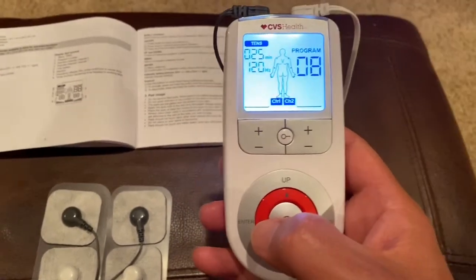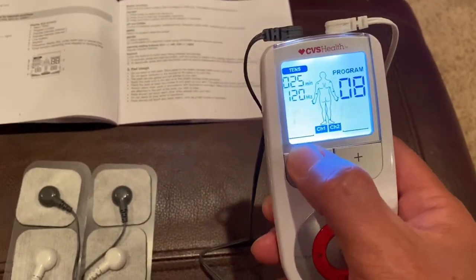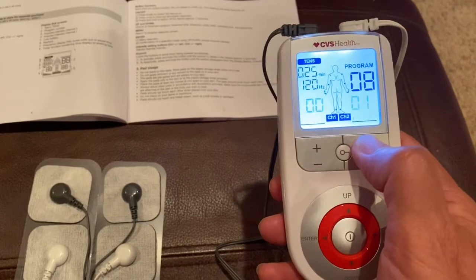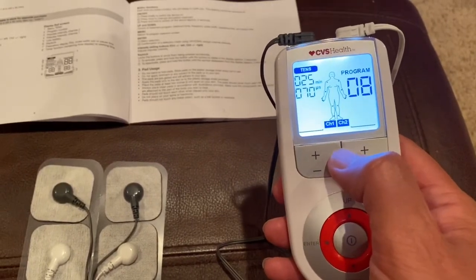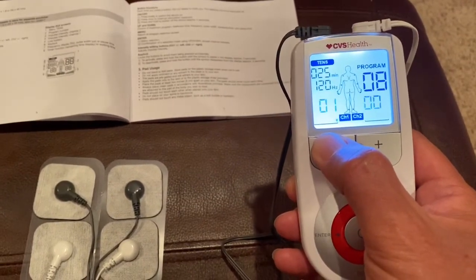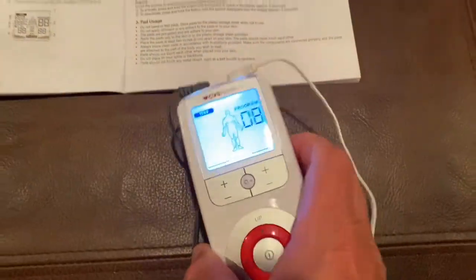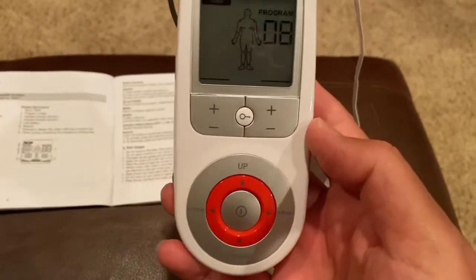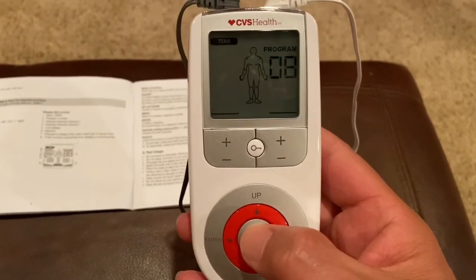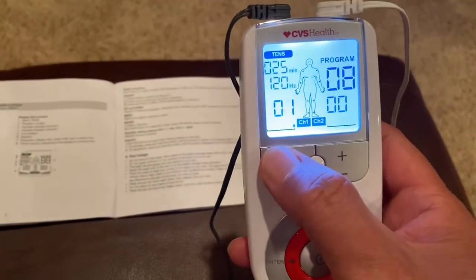We want to start Program 8, so we hit Enter and hold it down. When you want to start the program, you hit Enter and then increase the intensity. Also important to note: if you don't have your unit on your shoulder, knees, or back — with the pads already hooked up — it's not going to start. You have to get them on there, then press the Enter button, hold it, and then start the intensity.